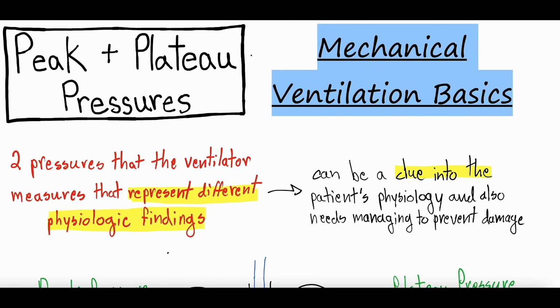Things like barotrauma, where the lung gets too distended, the alveoli get too distended, and as such they get damaged. But to further understand some of these concepts, it really is helpful to dive into what these pressures are representing.